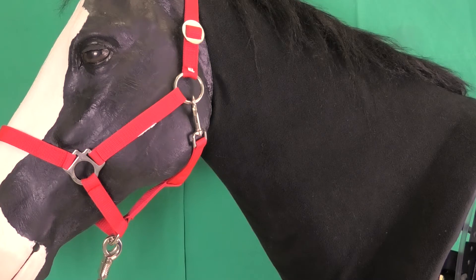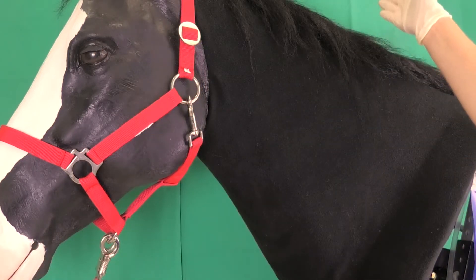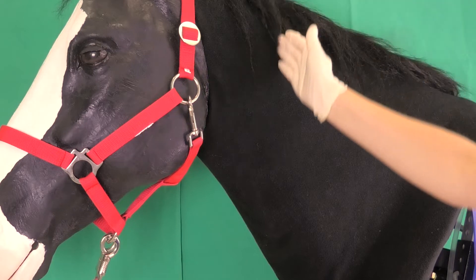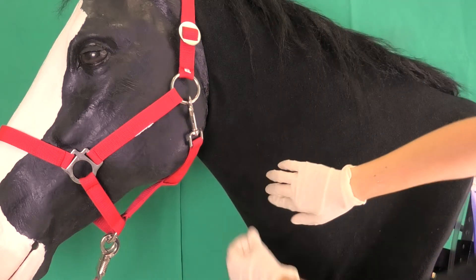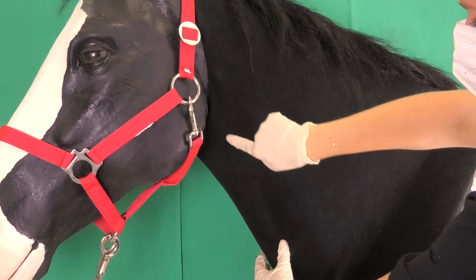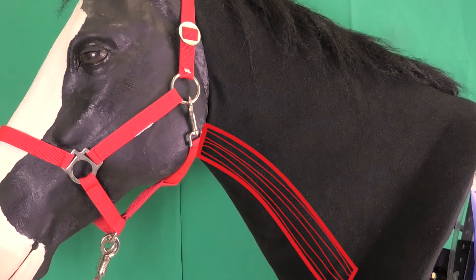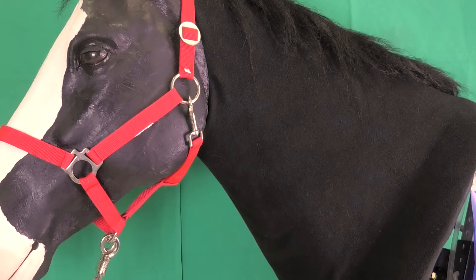The next step is to locate the correct puncture site in the jugular vein. It is located at the transition from the proximal to the middle third of the neck. Here, the common carotid artery is covered by the homo hyoideus muscle, which minimizes the risk of an accidental puncture of said artery.